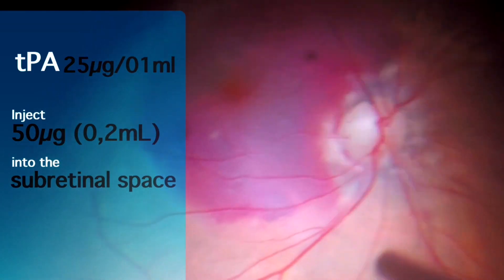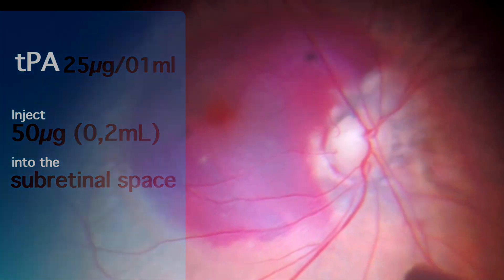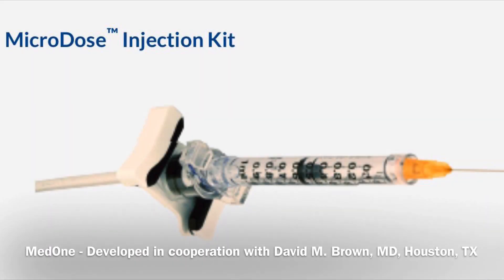Now you have to inject 0.2 milliliters of TPA solution into the subretinal space — but how to inject such a low volume in a controlled and predictable way? MedOne has a microdose injection kit commercially available, but if you don't have it or if you want an affordable option, you can follow the next steps.